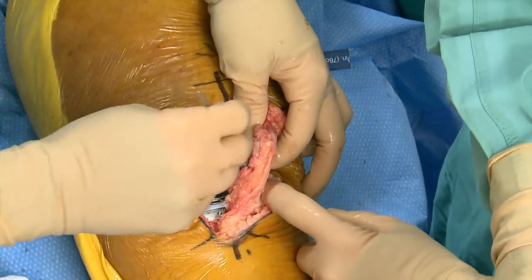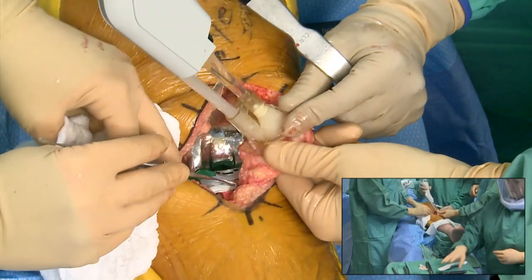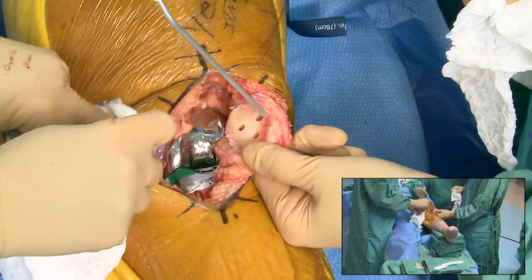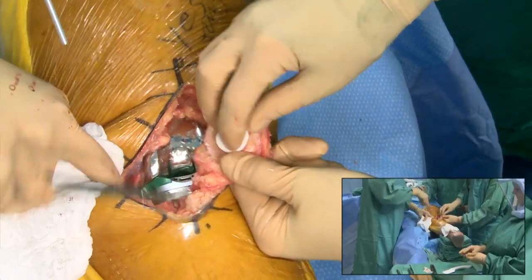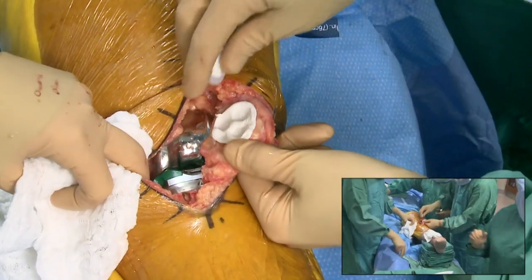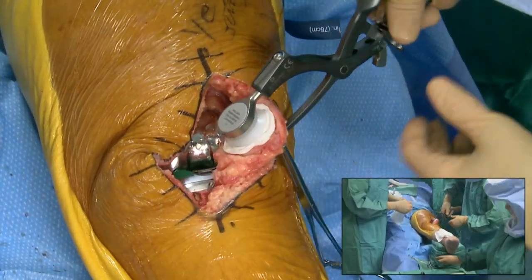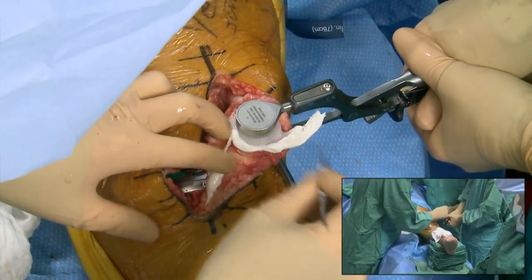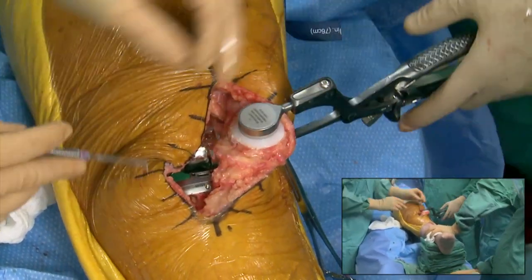Leaving it in full extension until the cement is hardened is really important. If you're moving the leg while the cement is curing, there are going to be voids, and you may have a happy patient in the lucky 80 percent but they may not be happy in 10 years when you're revising them for loosening. It does take extra time to wait, but I think it's worth it. We'll compress the patella as well. Parts are all cemented in.